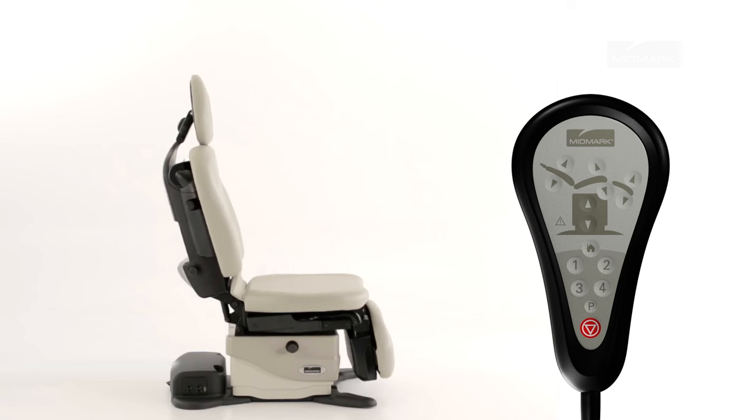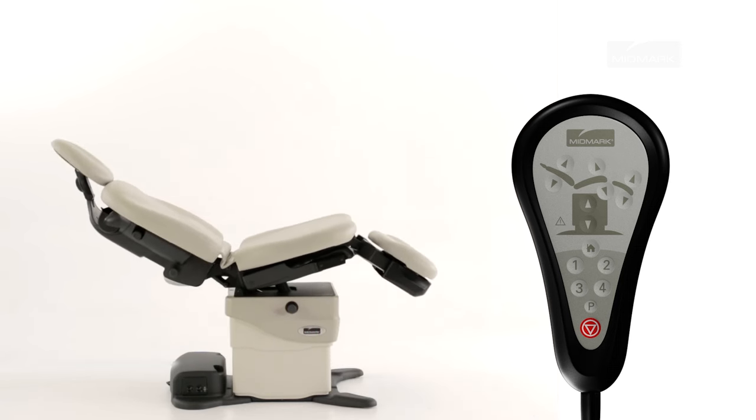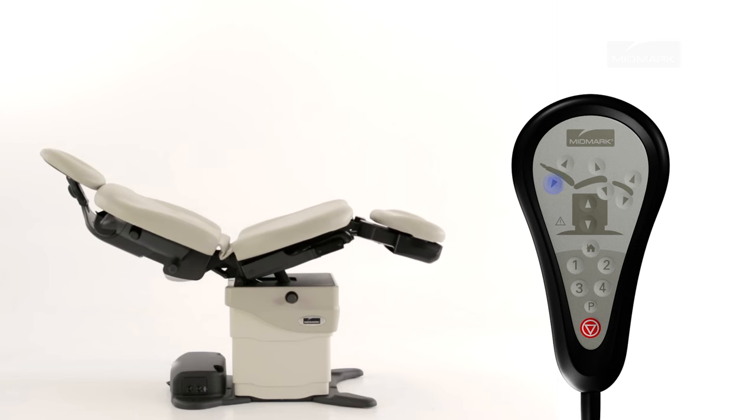The base, back, tilt, and foot functions may be activated at the same time. To activate multiple functions, simultaneously press and hold the desired buttons.